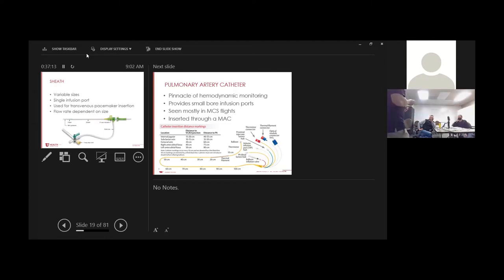This doesn't quite make sense to me. In a resuscitation? Oh, only procedural, right? Yeah, but it depends on what your facility stocks. Some stock 9 French single lumen sheaths. So basically, imagine something this size, just with this coming off the side. It's not common, but it happens. But you're right, it's not the line of choice for resuscitation. Usually they're used procedurally.